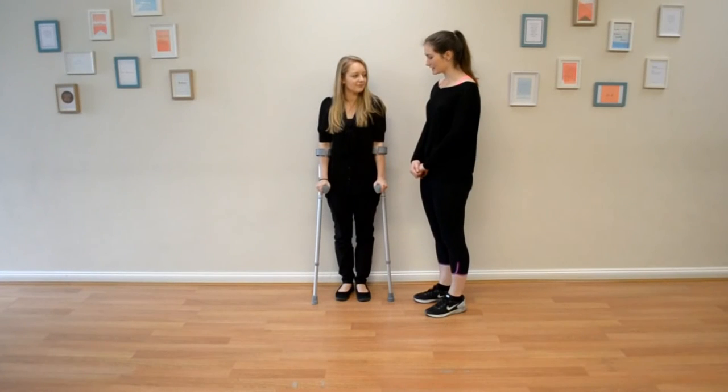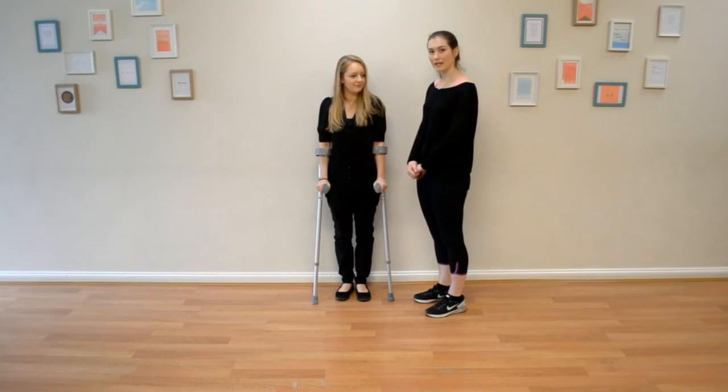Now Alex needs to learn how to use crutches for the first time. Alex has injured her knee and because of pain isn't able to walk without crutches. She can put weight through her leg though, which is why she's using these crutches rather than the bigger ones that go under her arm.